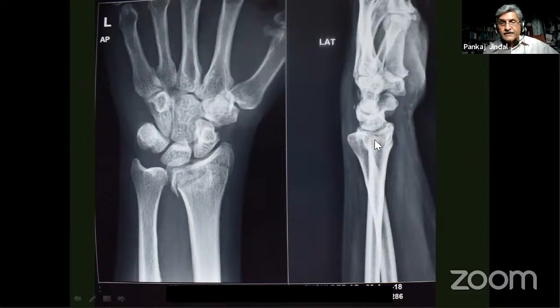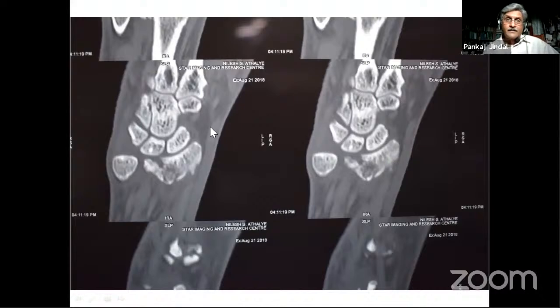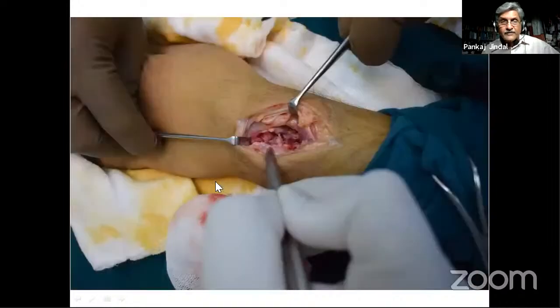So if you miss something on the lateral view, which is distal radioulnar joint instability or subluxation or dislocation, you can have gross loss of pronation supination here. He came after almost 1 month, and there was involvement of the distal radioulnar joint. What we notice here, the ulna has gone with the dorsal fragment. And therefore, what he required was not the reduction of the ulna, but if you reduce this fragment here, the ulna will automatically fall into position.